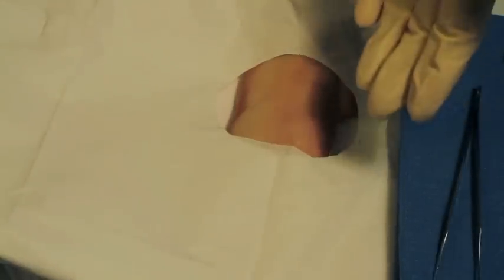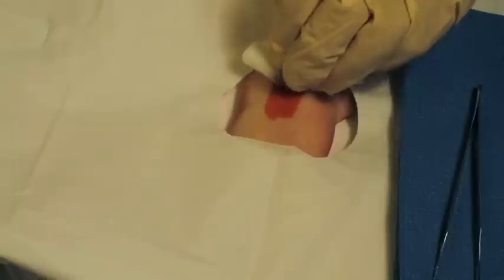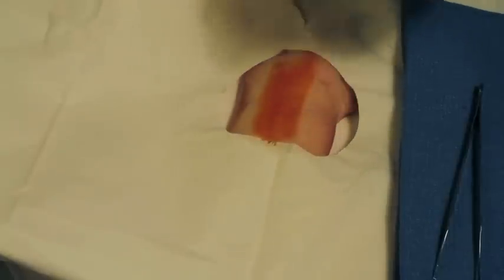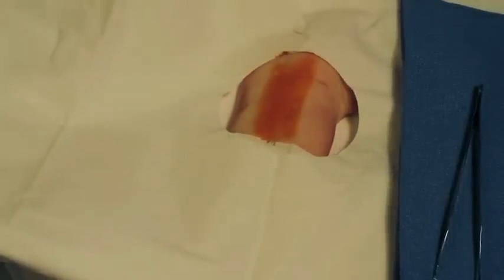Get all your equipment together and place it near to you so you can reach it pretty much any time. After this we're going to clean that area with some povidone iodine solution, otherwise known as betadine. If you have to, you could use alcohol, but we're going to use betadine today, and then we're going to make an incision.